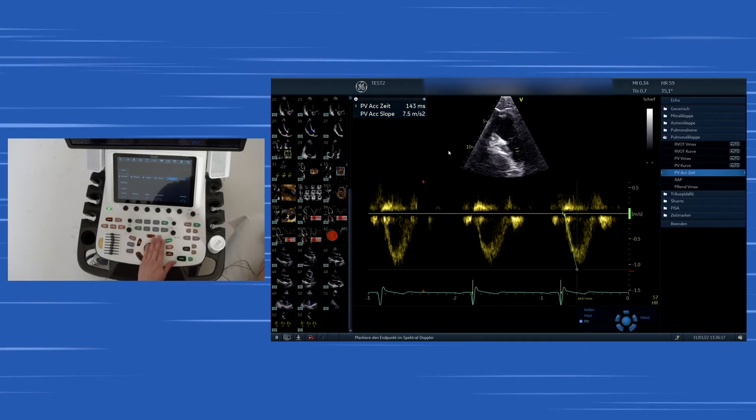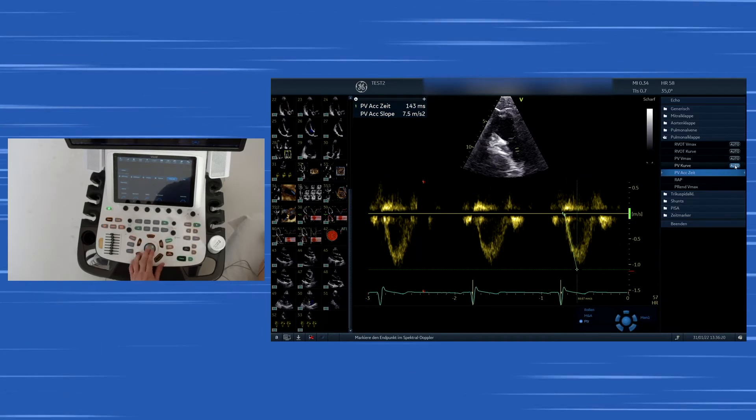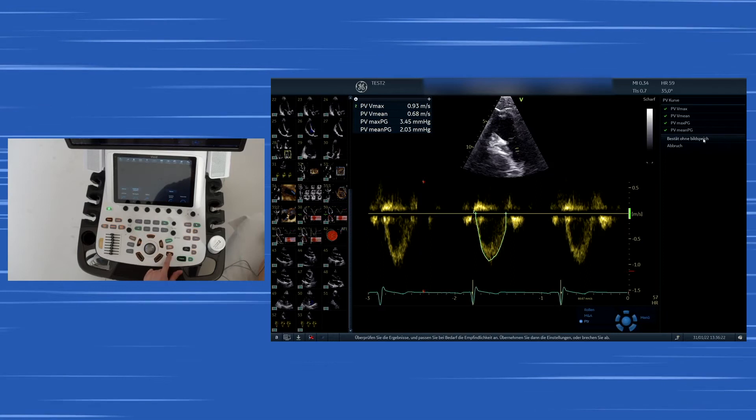Then you can also measure the curve. You can try an automatic measurement which works in this case very nicely.